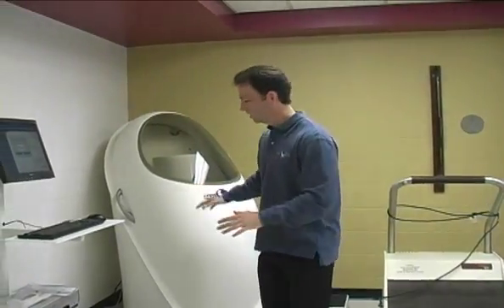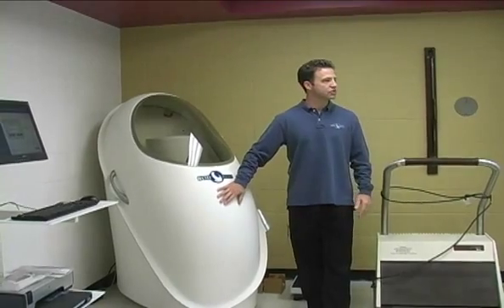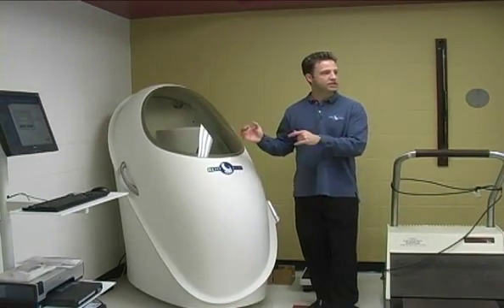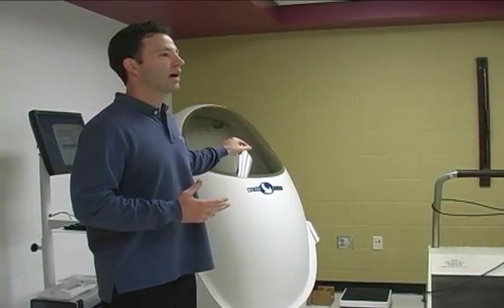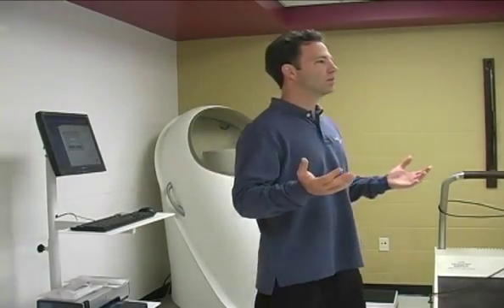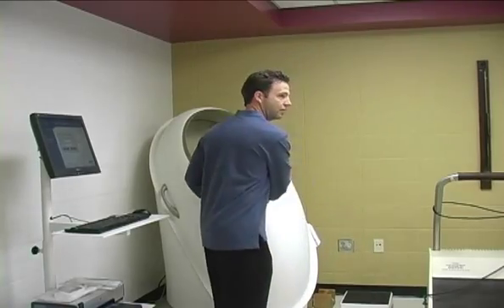So the BOD pod. Somebody mentioned a spaceship. A lot of people mentioned giant egg and so forth. It does have a unique appeal, a unique design. A little history about the company and the BOD pod. The technology is air displacement plethysmography. Say that five or six times real fast. We just abbreviate it. ADP is the technology of the BOD pod.